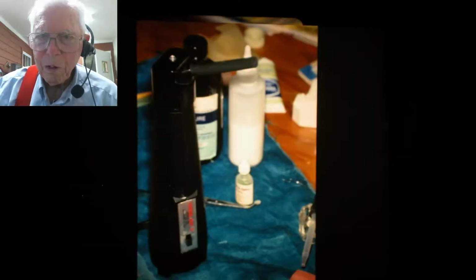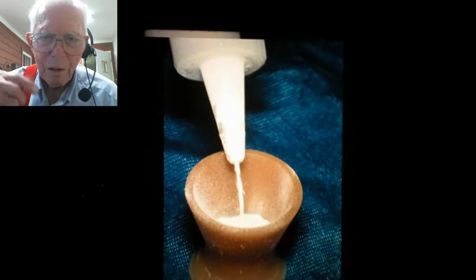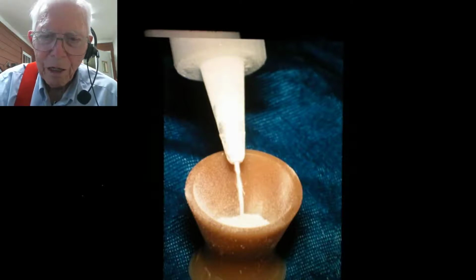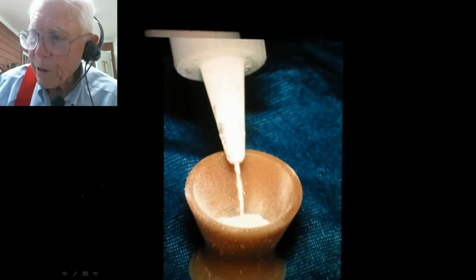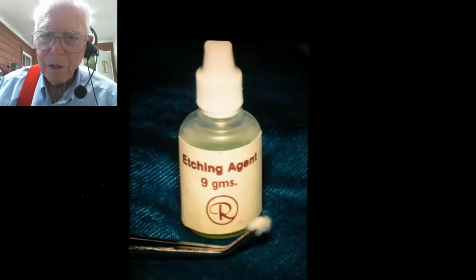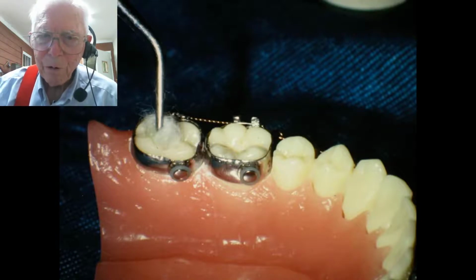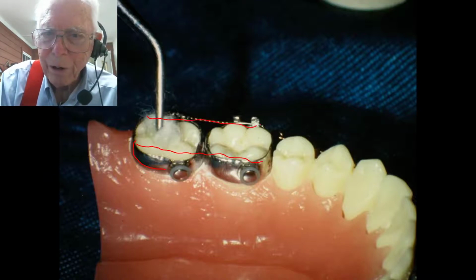And here we take some etching material, and we are going in and etch the surface of the teeth. And you just put a little of that acid on the surface of the teeth and wash it off and dry it and etch the teeth real good, just like you regularly do. And now I'm pouring some plain acrylic into this, and we'll put a good bit of it, and then we're going to put some liquid in it, just enough to make it fairly solid. And here we'll take that powder, this is the etching agent that we put on there, and here we put that on the cotton down in there to etch it, and then wash it and dry it. And now we're going to come in, and when you bond it, you don't have to wrap the tooth up. You can cut it off on the sides and just have it bonded across like that.